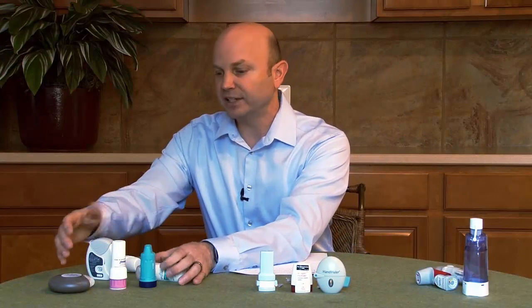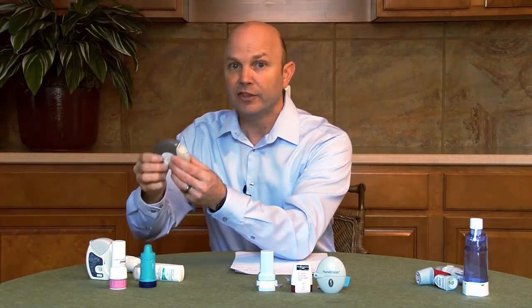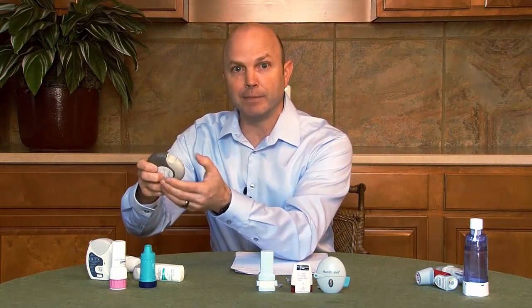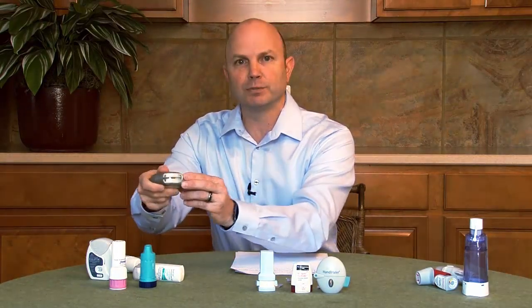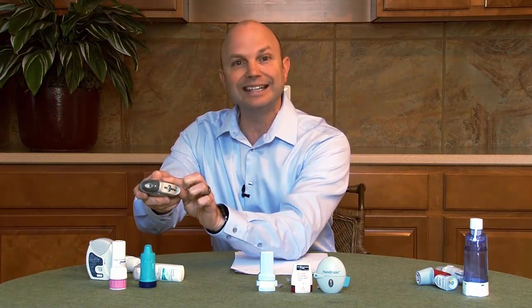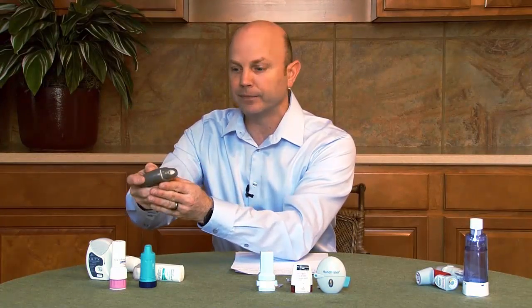The other thing about these devices is some of them have rather tricky mechanisms to load the medicine. These are not toys, so please don't play or try to inspect them. It's really important to read the manufacturer's instructions. For this device, you can open and close the cover as much as you want. But as soon as you press this trigger, you release that medication, and then it's going to be inside the mouthpiece, and if you blow or dislodge it, that medicine will go away.